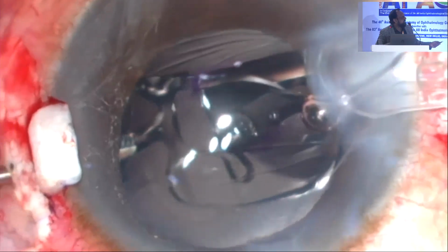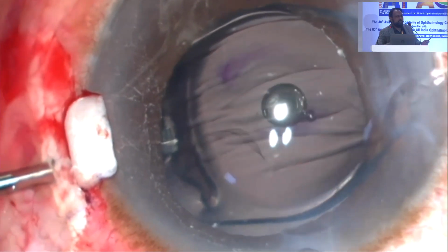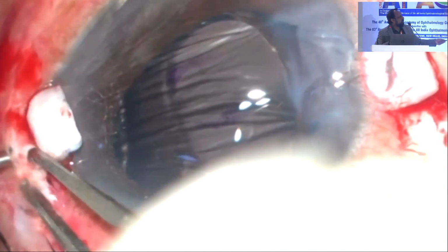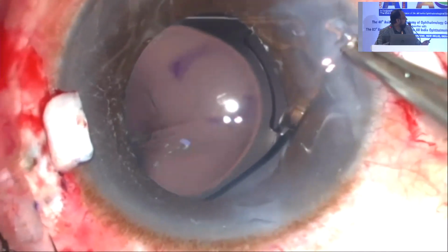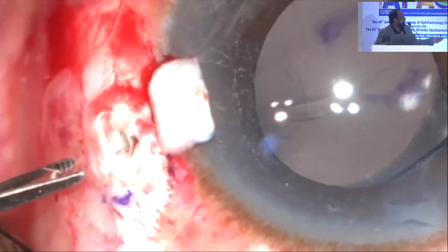The second trick is, since it's a single piece lens, inject the remaining of the lens after holding it, otherwise it can detach again. So make sure you have the trailing haptic at the wound or over the iris, and once the lens is free from the cartridge, pull the haptic out, and then you see a pop and the T opens up. So once that is done, it is literally over.